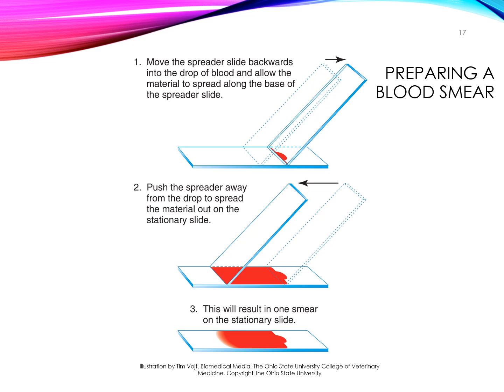Preparation, again, should always be done with clean slides. It is a skill that requires practice, but you can get it eventually with consistency. Again, you can try several different methods, but most commonly we use this method here. And you can see here, this is from the pull back method. So this is the opposite of what was in the animation. So you put the drop of blood down, you pull the spreader slide into the blood, and then you push forward. And looking at this smear here, technically this is not a very good smear.